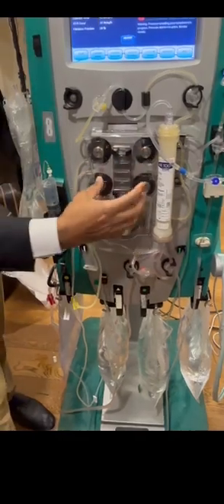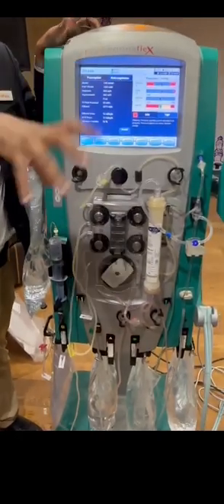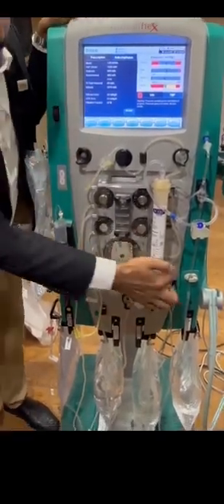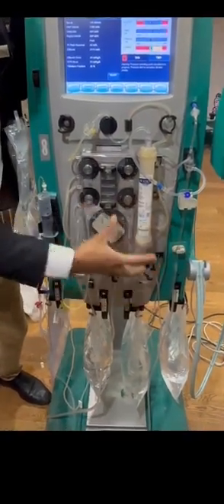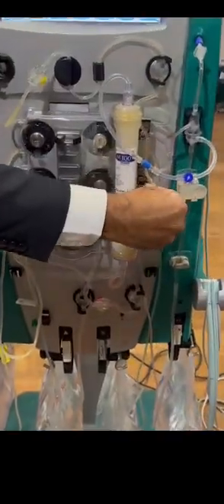So these three are completed. Now the solutions, all the solutions which we give in the patient circuit as well as in the patient blood vascular region, we have to remove all of this. That will start here, the yellow line. So all these three are giving into the circuit, and this we are taking from the circuit.